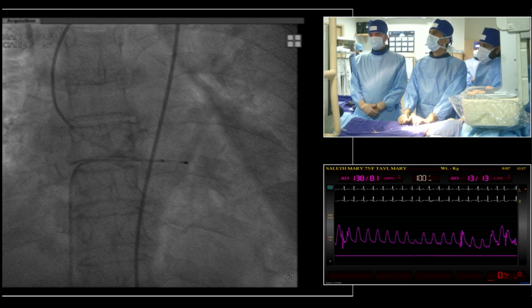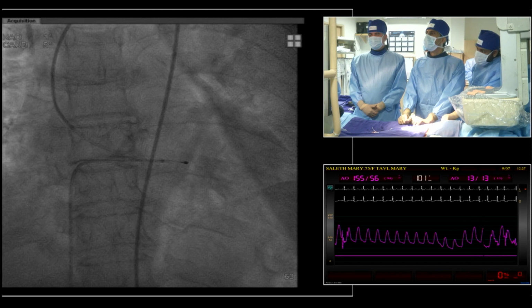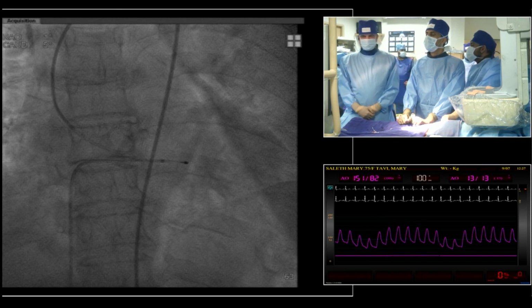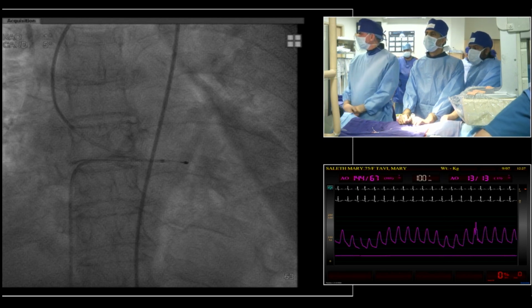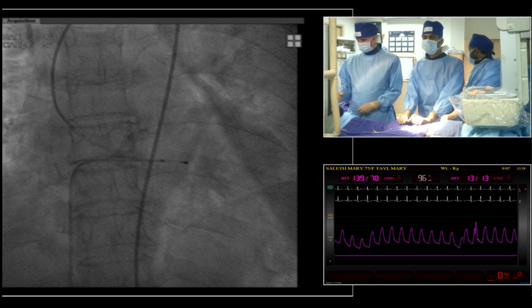There's also the situation of anterior calcification, which I think should be discussed. I don't practice it, but some people leave an overnight wire crossover for bailout. When you close with Perclose, there's an advantage of stopping blood flow, a dry Perclose, which means that if you stop blood flow, your Perclose works more rapidly.